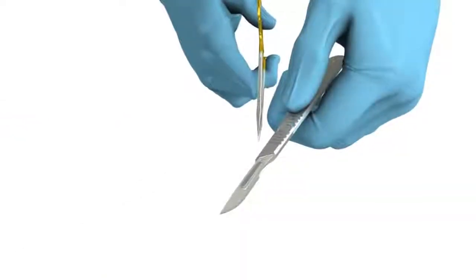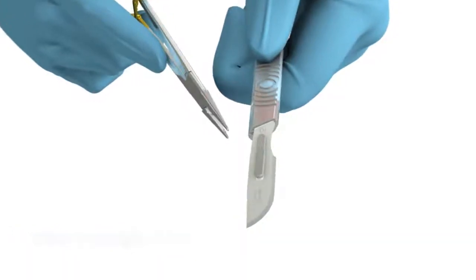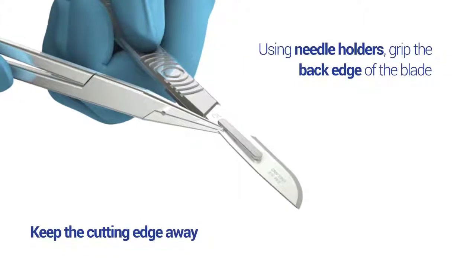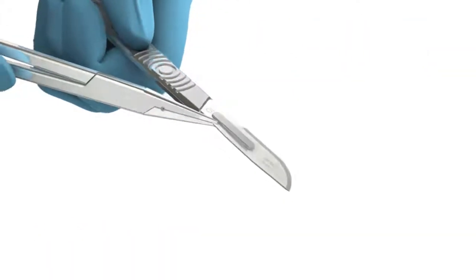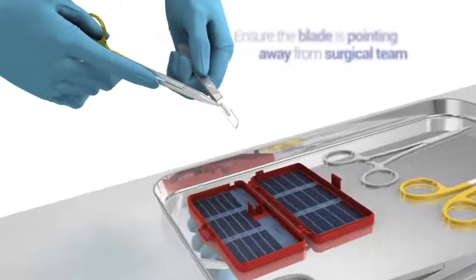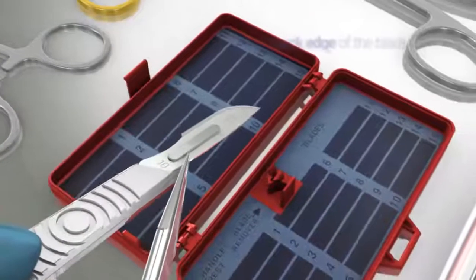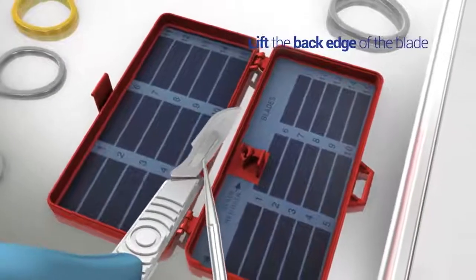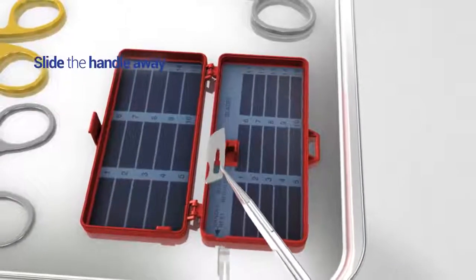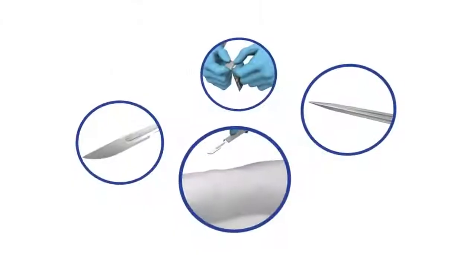To safely remove the surgical blade from the handle on completion of the procedure, grip the blade with the needle holders towards the back edge of the blade, making sure that the cutting edge is facing away from the hand and body. Ensure the blade is pointing downwards towards the instrument tray and away from any members of the assisting surgical team. Whilst holding the handle firmly, lift the back edge of the blade with the needle holders and slide the handle away from the blade and place it into a needle counter box or container for the final count.